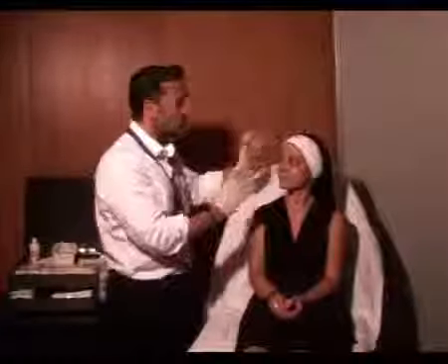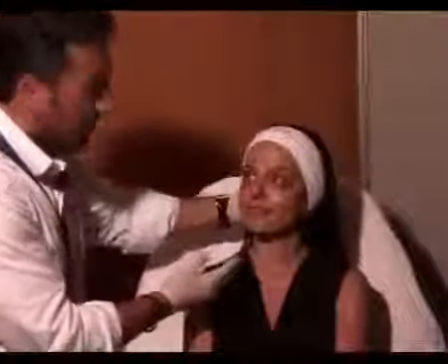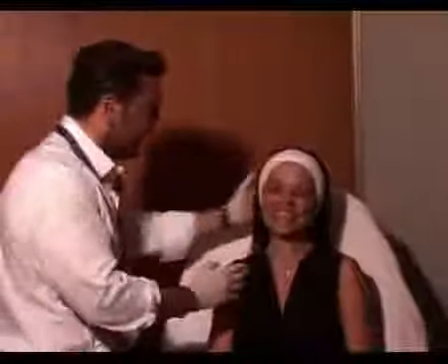So let's start. The most important thing is to try to assess the patient. And what we're going to do is focus mainly on the T troughs for this case. So if you look straight here, how old are you? 37. Okay.